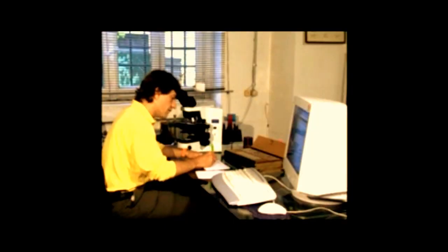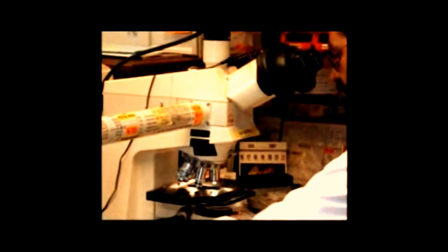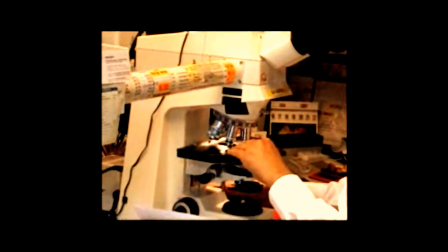The authors, in 1 year full of stimulating discussions and fruitful cooperation, have developed a computer program containing two main features. On the one hand, it would help its user to store and retrieve the plethora of details associated with dermatopathological concepts and entities.